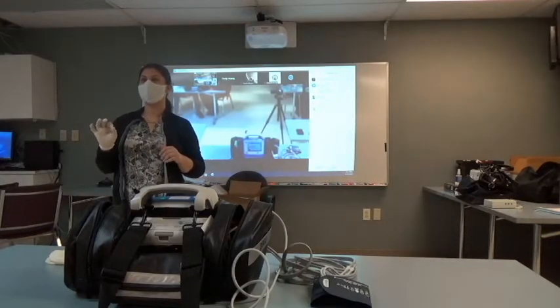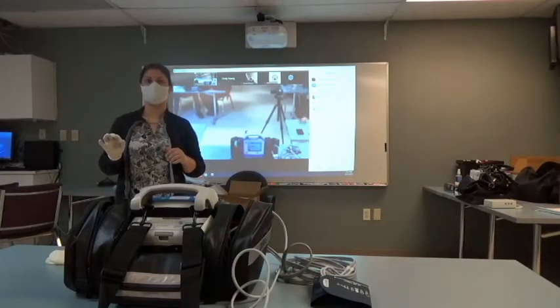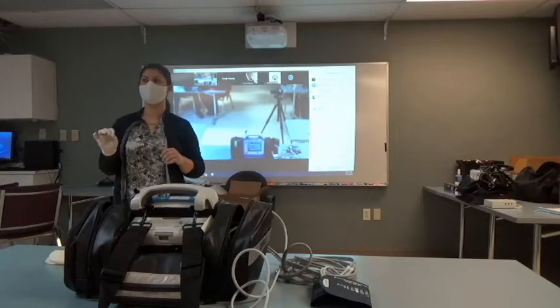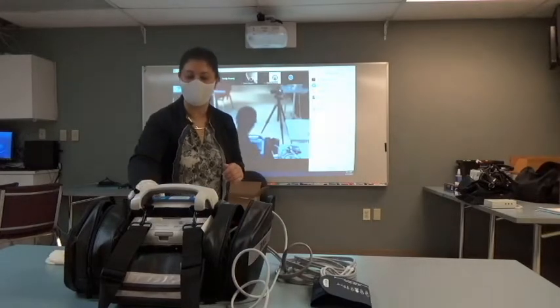So is everybody on manual mode right now for their blood pressure? Is anybody still in automatic mode? Okay. All right. Go ahead and hit your home button.